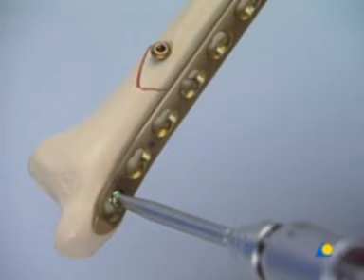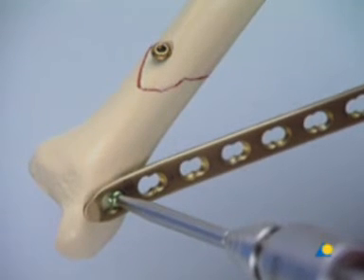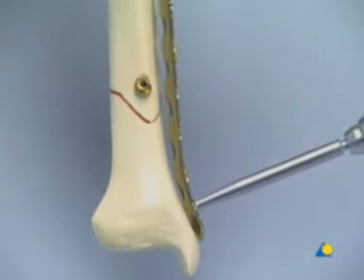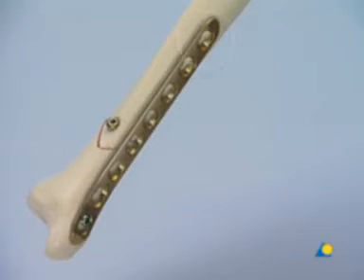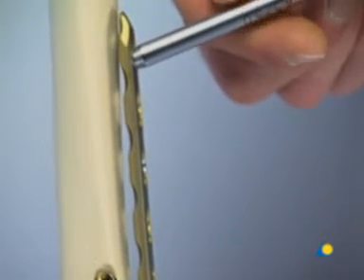At this point, if the other end of the plate is not well secured, the helicopter effect will be created. Therefore, before completely tightening the first screw, the plate is fixed to the bone using the most proximal screw hole. The LCP drill sleeve is gently screwed into the threaded part of the combination hole.